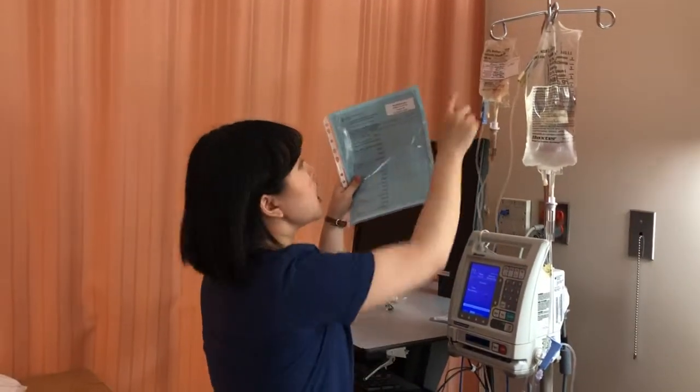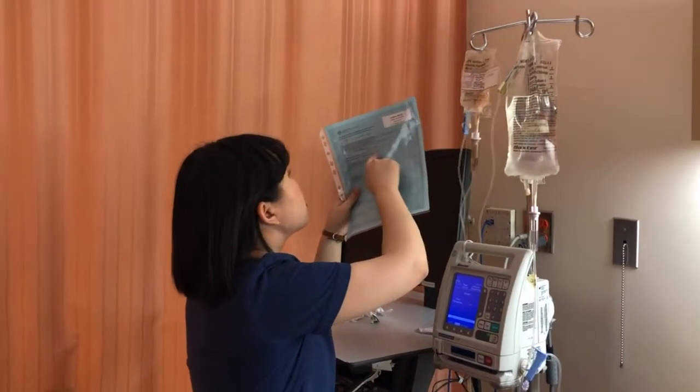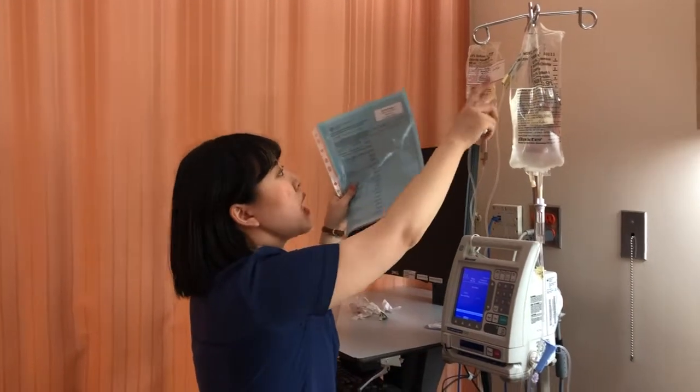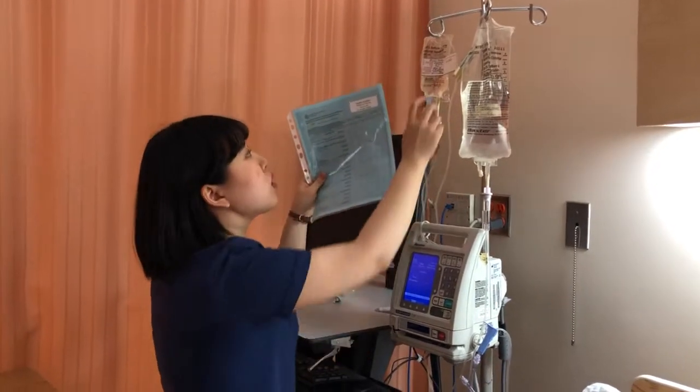So this is my second check. And right drug. So it's Humulin R, and it's a continuous infusion, and it's 2 units per hour. So it's going to be a rate, and my dose is going to be 2 units per hour.